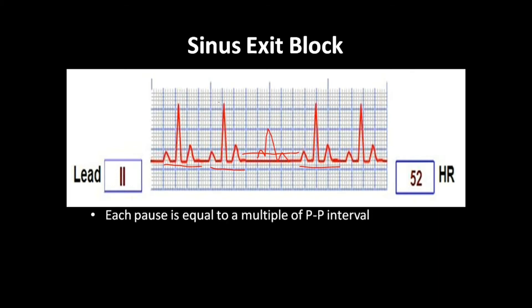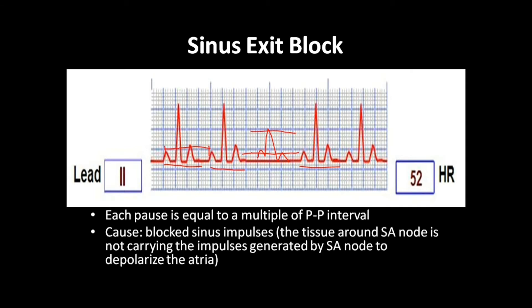Each pause is equal to a multiple of the PP interval. The PP interval is measured from the beginning of one P wave to the beginning of the P wave in the next heartbeat. The isoelectric line will be a multiple of the PP interval.